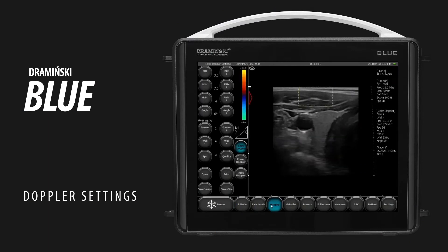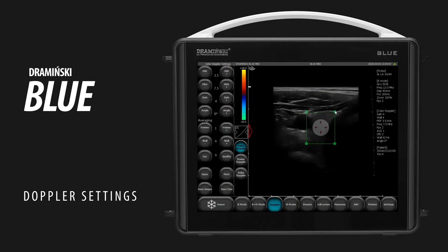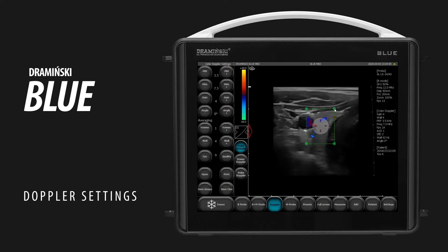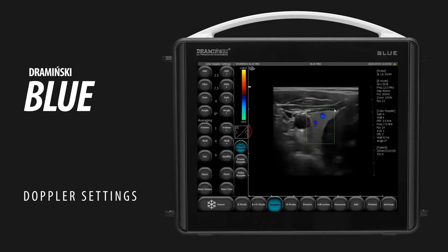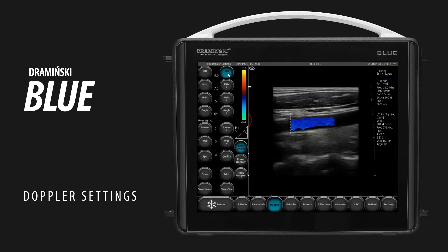Tap Doppler to turn on the color Doppler mode. Drag and drop to move the color box. Use one of the knobs in the corners of the box to change its shape and size. Use the PRF buttons to adjust the scale.